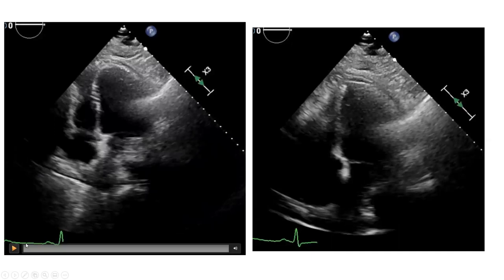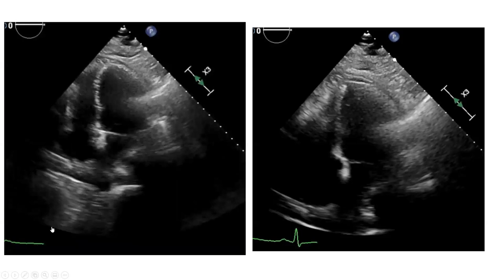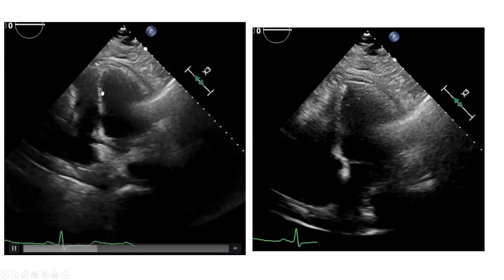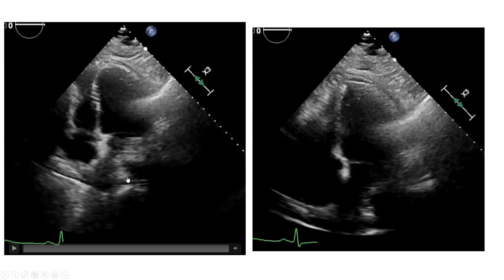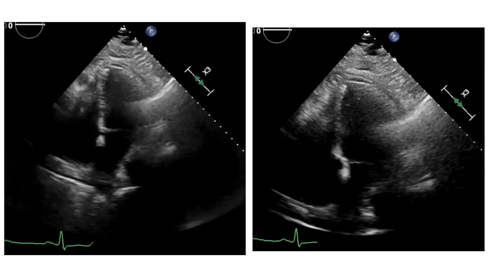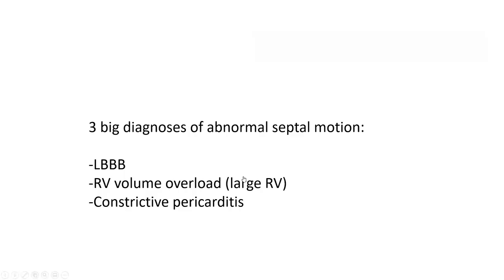It's very easy. This patient doesn't have left bundle branch block on his EKG — you can even measure the QRS width. Number two, he doesn't have RV volume overload; that RV is small. So just by looking at that very simple echo frame, you can tell this is a good probability of constrictive pericarditis.